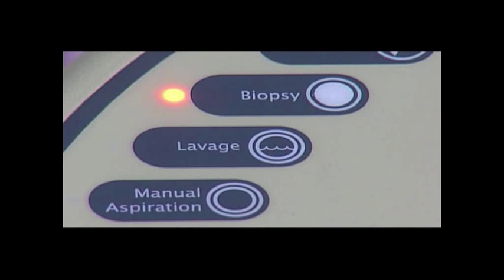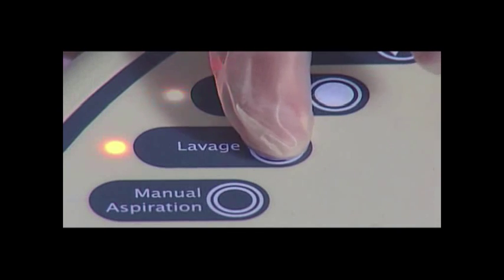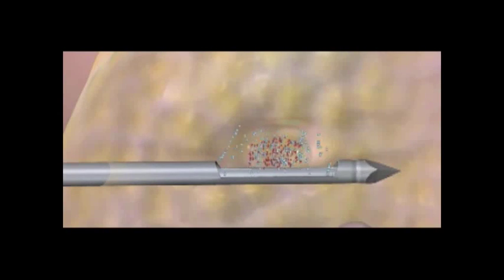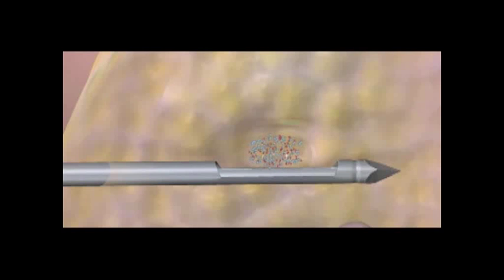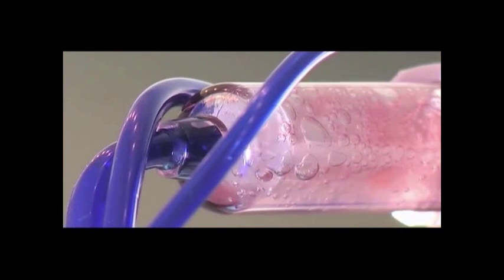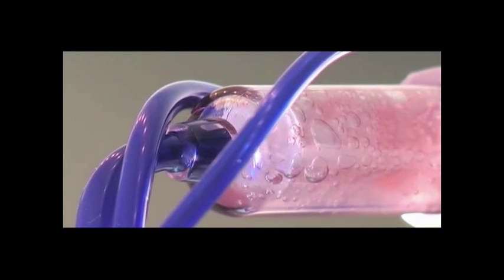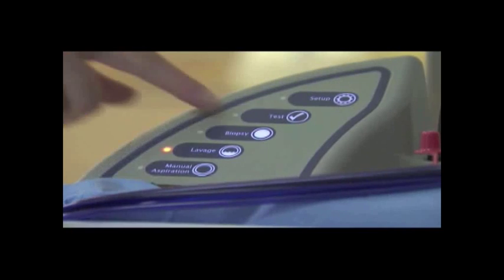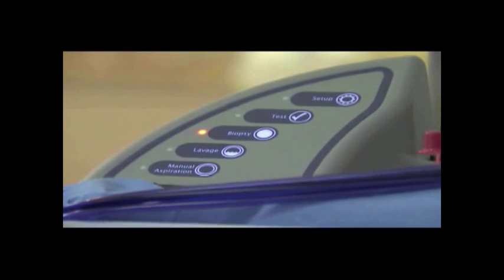After tissue acquisition is complete, switch the console to lavage mode by pressing the button marked lavage. Lavage continuously irrigates and aspirates the biopsy cavity, allowing loose tissue and other fluids to be cleared from the biopsy site. Lavage the cavity until the fluid collected in the tissue collection chamber indicates the cavity is clear. Switch the console back to biopsy mode by pressing the button marked biopsy.